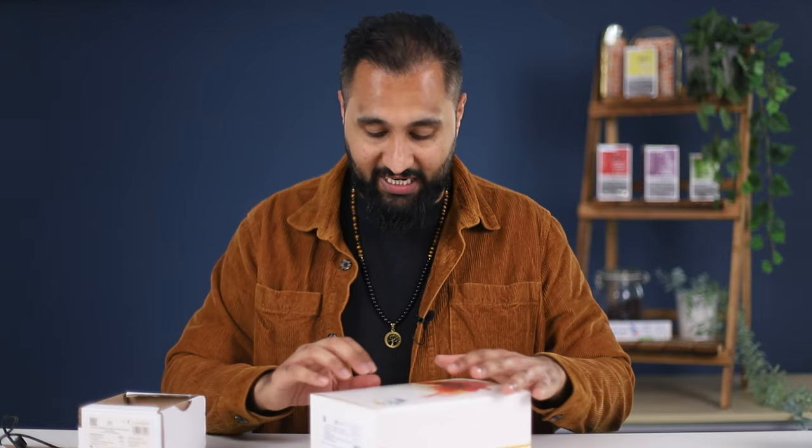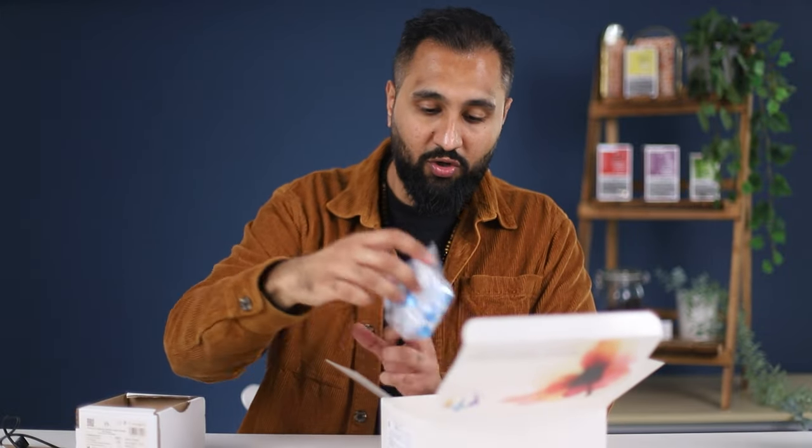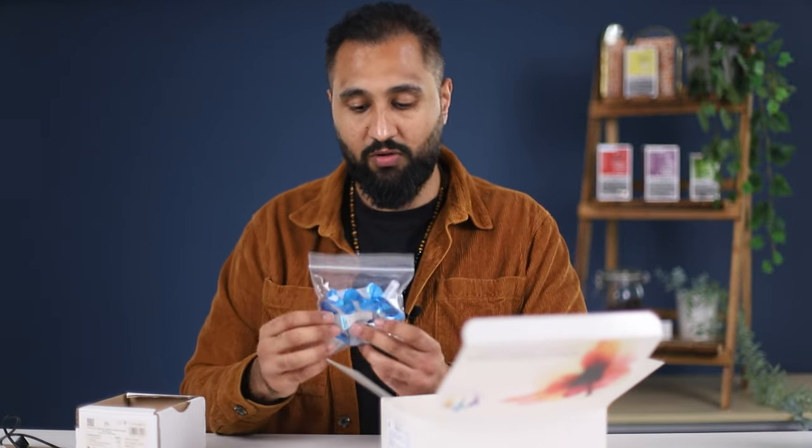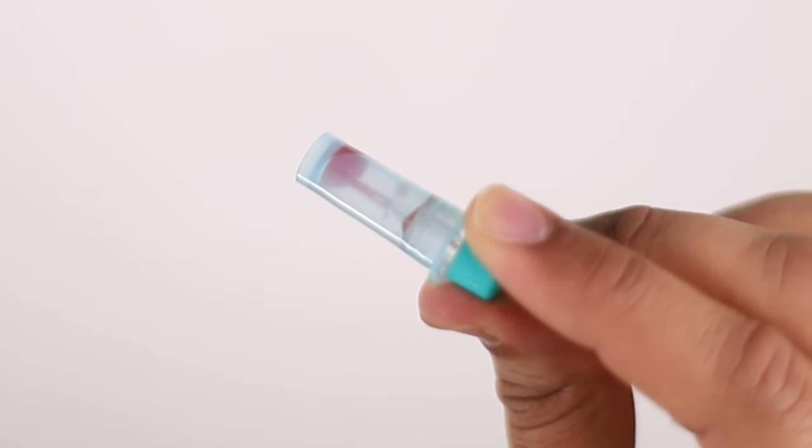And then your vitamin D test strips. In your box of test strips you will receive your capillaries — these are what allow you to collect the blood from your clients' finger prick sample. It looks a bit like this. And then you've got your sample collecting tubes, which are pre-filled with the vitamin D buffer solution. The solution is what splits the blood and allows us to test for vitamin D.